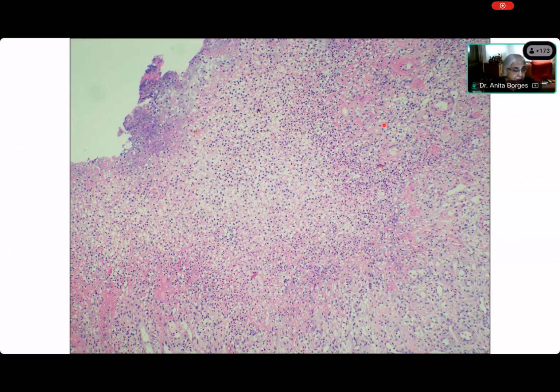But now, who was describing this? Deepali, you were describing it. So now, what do you see here? We're doing a seminar on spindle cells, right? Do you see spindle cells? No, ma'am. Here, proliferating capillaries and fibroblasts are seen. Proliferating capillaries and fibroblasts. If you are able to see fibroblasts, my dear girl, then you are looking at spindle cells.